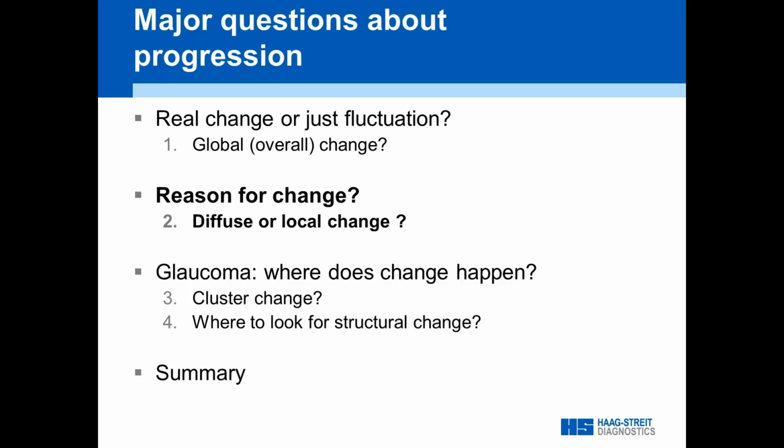But it really depends. You may have patients that are very slowly progressing, and then an unfilled arrow is a strong message, especially if you have just a few fields. If you have a very fast progressor, it should fill quite quickly. But obviously, filled is a higher level of certainty.